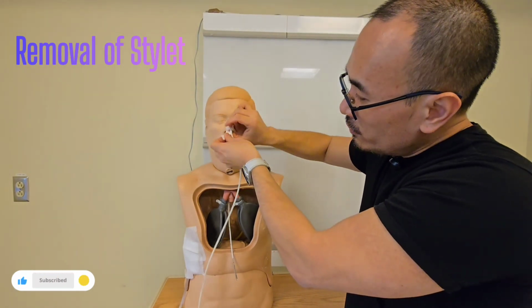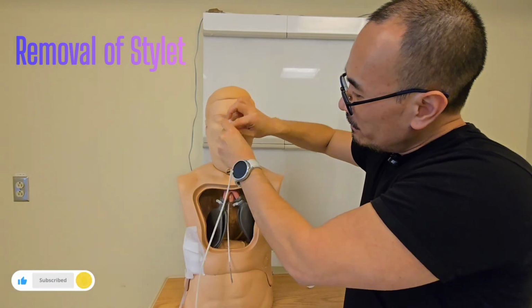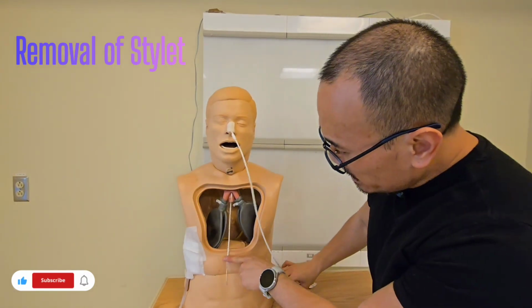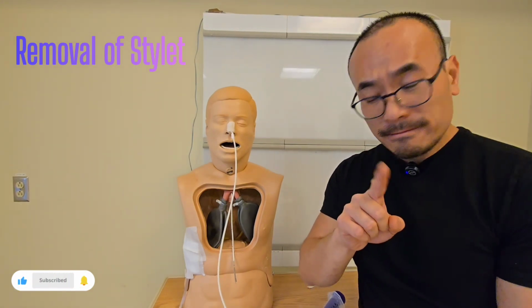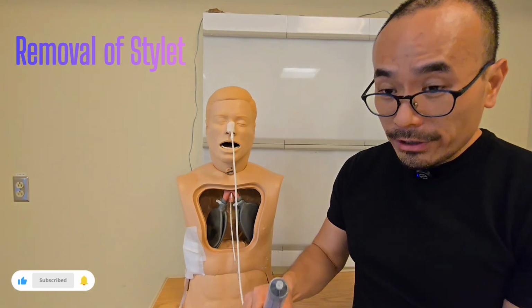You can use a brand new dressing if the previous dressing has become non-sticky, or if this dressing is still good, you can keep using it, and watch. It's very secure in there. Once this tube is down in there, then we need to start removing the guide wire. In order to do so, we are going to grab another 10 cc's of water.